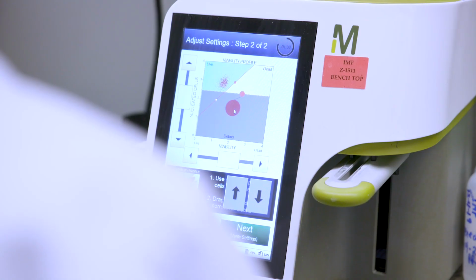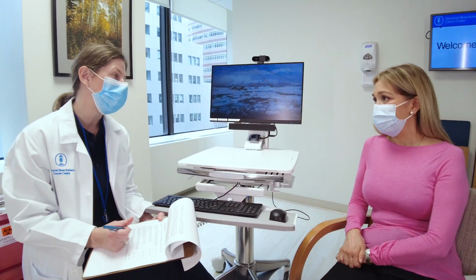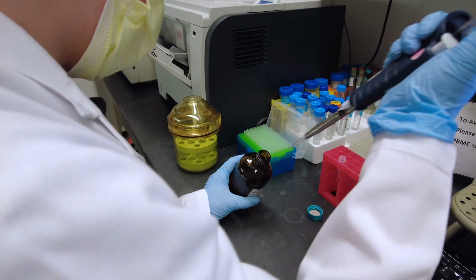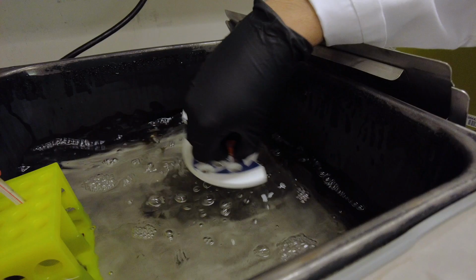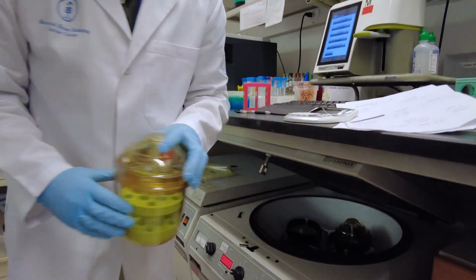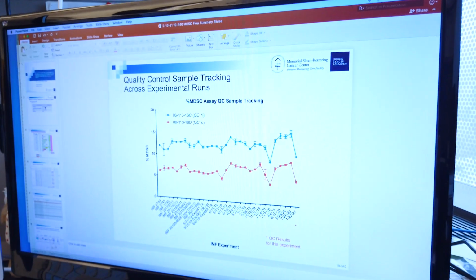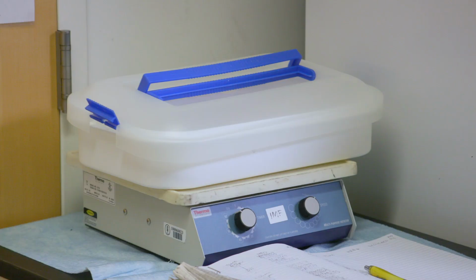One key component of immune monitoring of patients on immunotherapeutic trials is the clinical sample collection process. Peripheral blood is typically sampled in order to evaluate systemic immune responses, since it contains circulating lymphocytes, monocytes, and mediators that regulate immunity. Examining changes in these peripheral blood components may elucidate biomarkers that correlate with clinical activity.